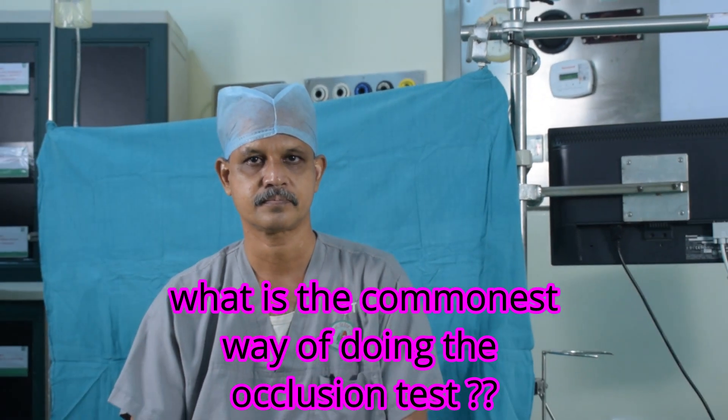What is the commonest way of doing the occlusion test? The commonest way, more commonly used, is the meniscus fall method.